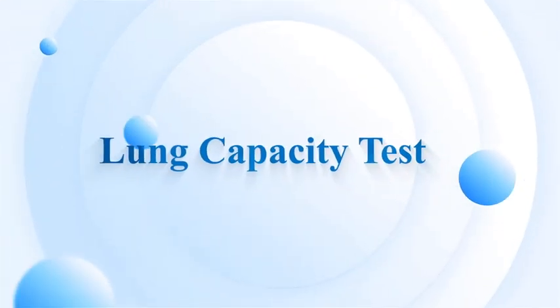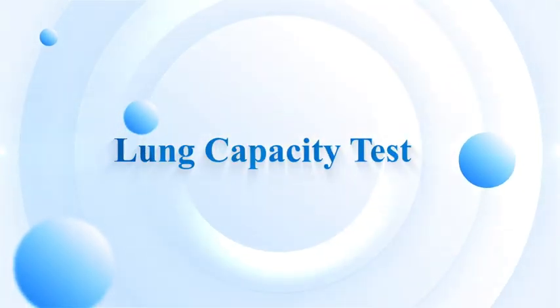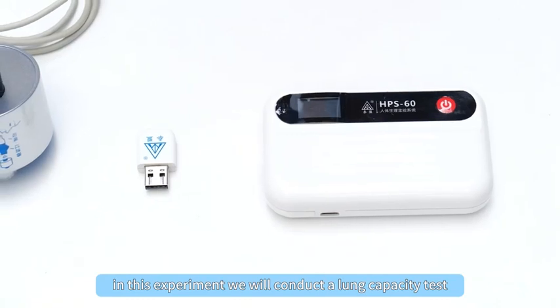Lung capacity test. In this experiment, we will conduct a lung capacity test.